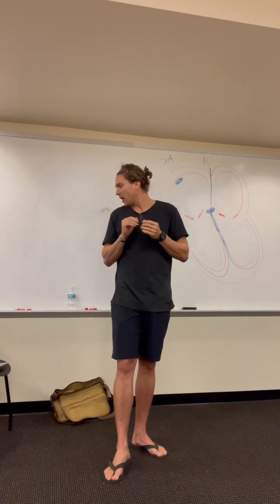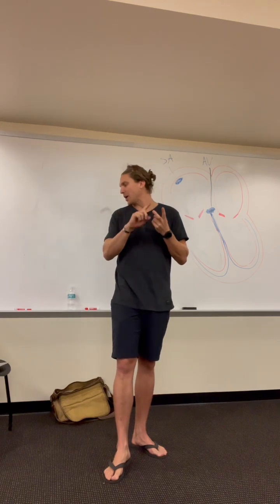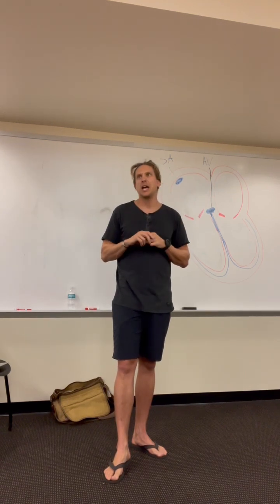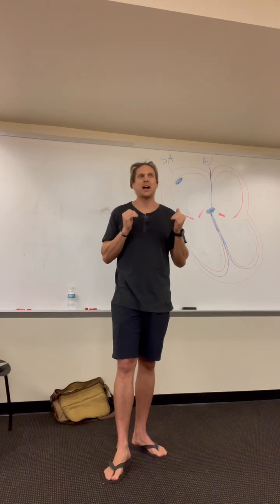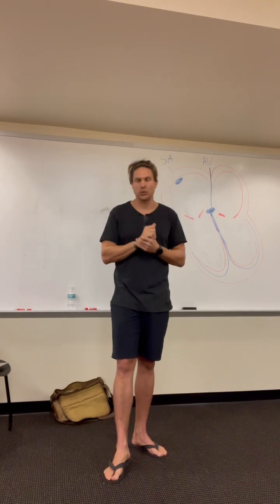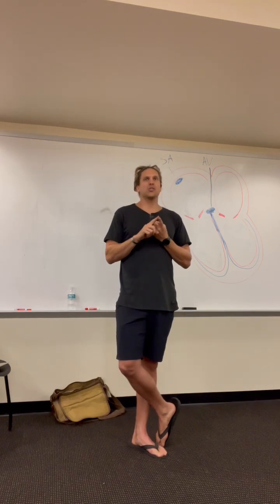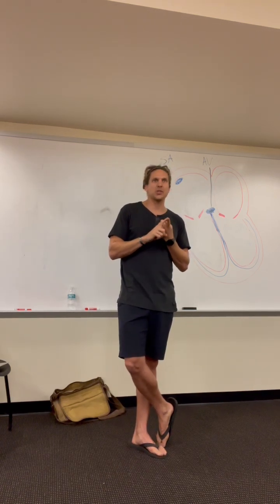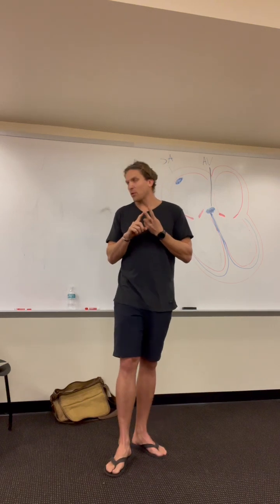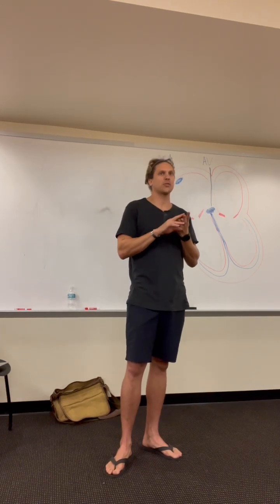I like what's on my slides here, the bold and underlined, just using rate, rhythm, QRS, and intervals. You guys are going to be able to identify all the rhythms being tested if you just do rate, rhythm, QRS, and intervals. And we'll go over each of those right now. Rate, she goes over how to get rate in her slideshow, so I won't go over it. For rhythm, ask yourself this: is there a P for every QRS and a QRS for every P wave?